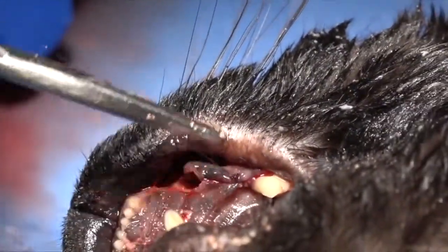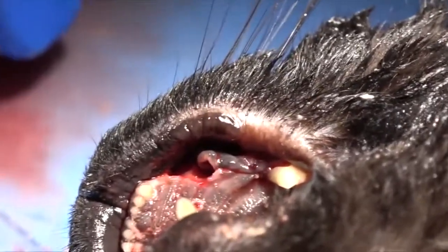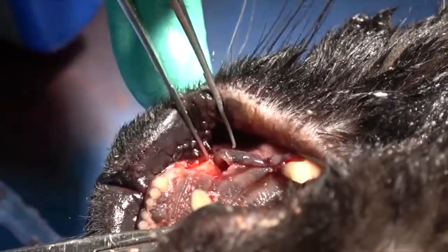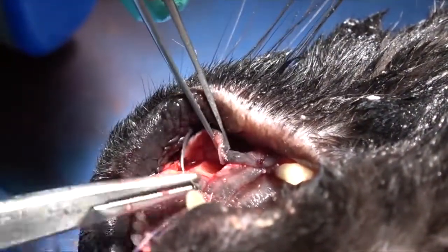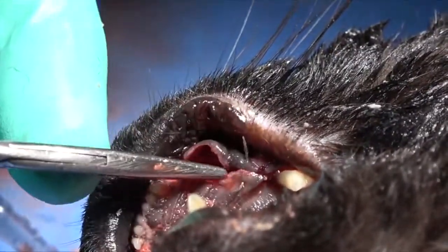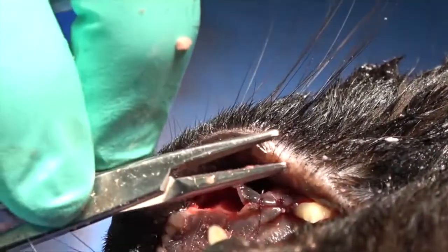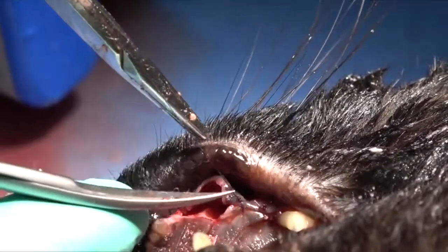We just did a surgical throw, two throws around, and then tie, then two simple throws and tie — and we're ready to move rostral. Sutures are about two to four millimeters apart depending on the size of the patient. You don't have to get really tight with these sutures; this is not an area that has any tension. When you have vestibular bone expansion, you actually have less tension because that tissue has expanded and thickened, making it easier to suture. Sometimes you even have to excise some of that tissue with scissors.